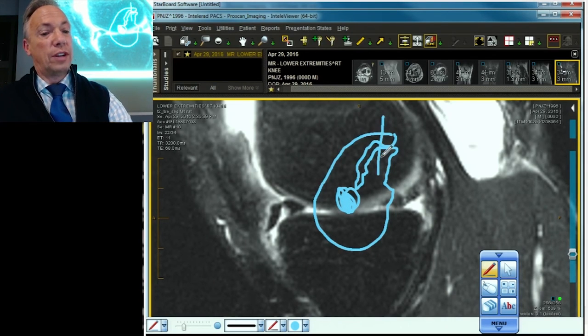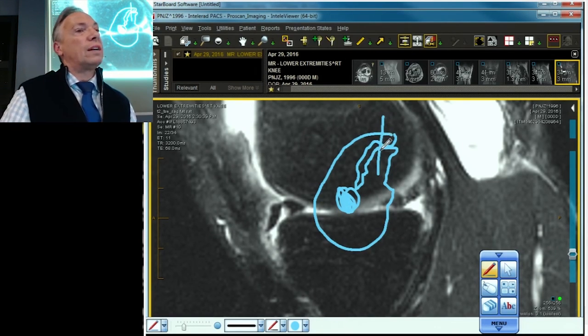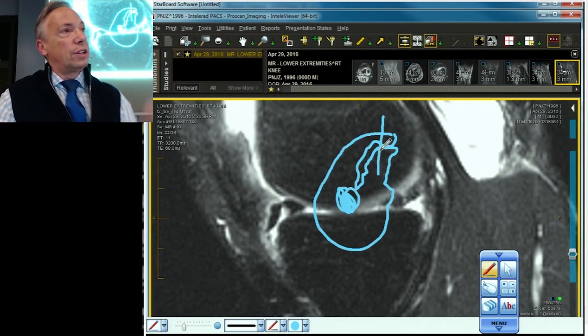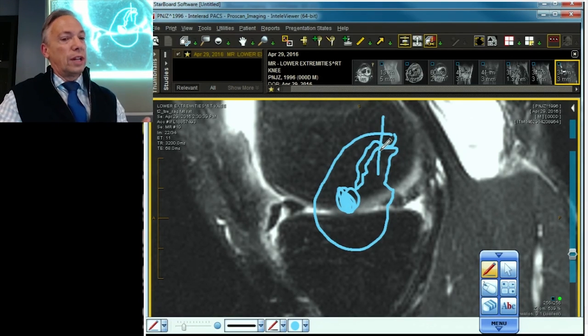Native meniscus shoved anteriorly, bucket handle fragment pushed anteriorly — the double anterior horn sign of a bucket handle tear. That concludes our discussion of bucket handle tears. You've got the central type, the anterior extended type, the posterior extended type, and the complete free fragment type.